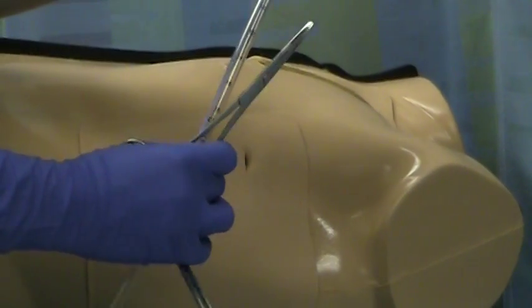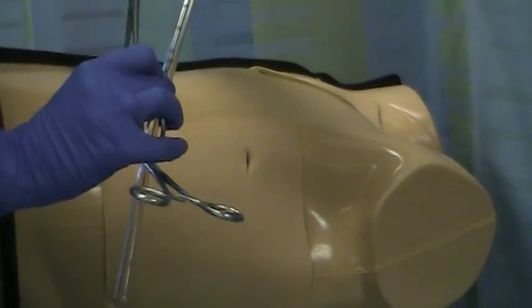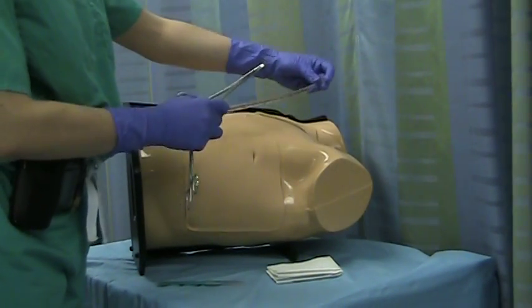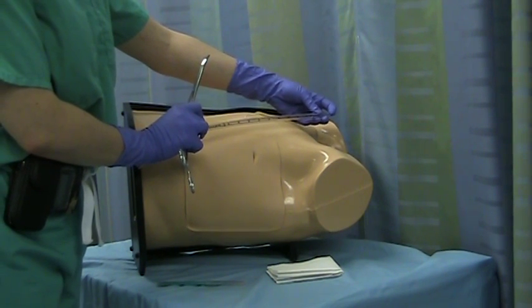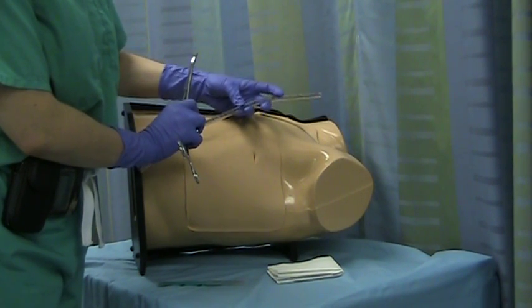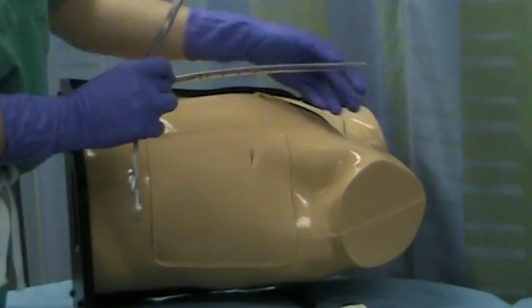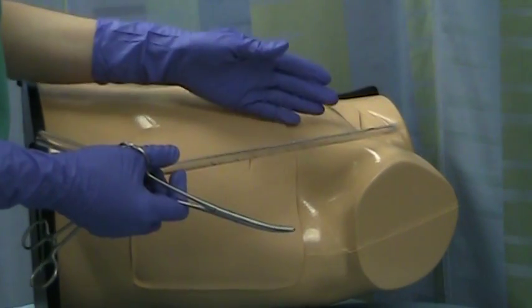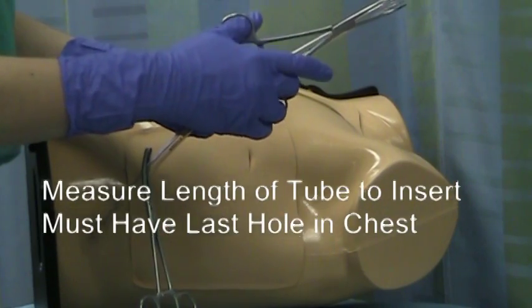Other things you notice, the last hole on this tube is right here, and shortly thereafter my numbers start. So I need to know how deep I want to put this in my patient. But oftentimes we'll look and just kind of gauge based upon the size of our patient where that lands. On this particular patient, it would land about 14 if I was aiming for the apex. Most important part is that that last hole is within the chest cavity rather than outside the chest cavity, because that tube will not function properly if it is.